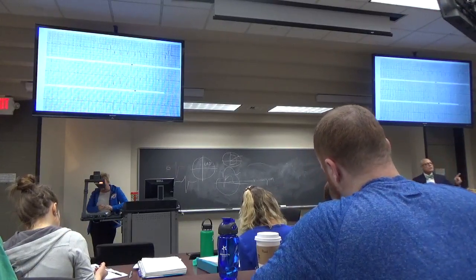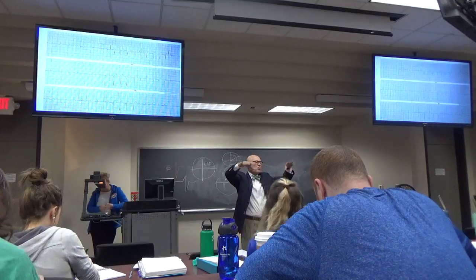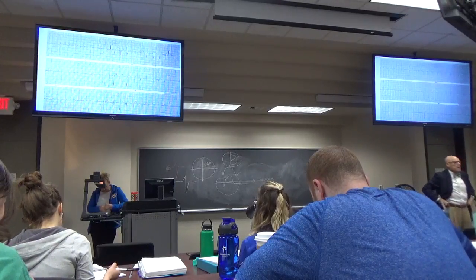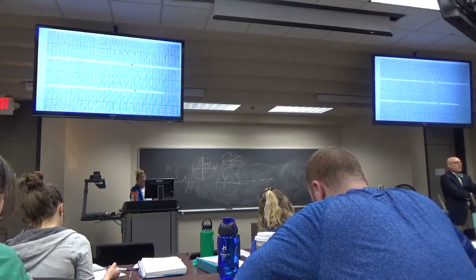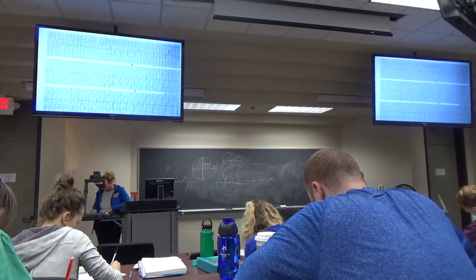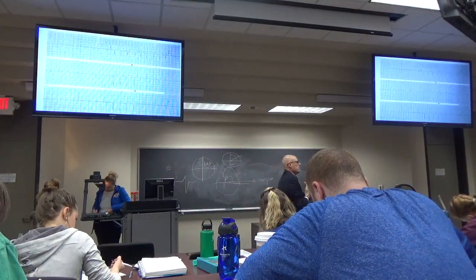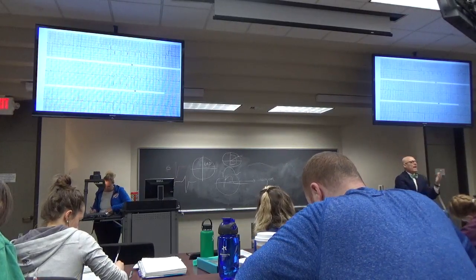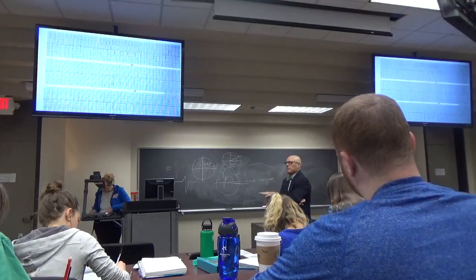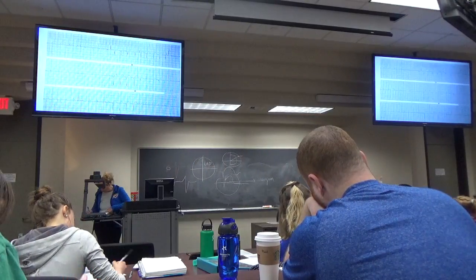Turns out, atrial fibrillation is one of the hardest rhythms to call on an EKG. Okay? Because there are almost always some squiggling going on in between R to R. There's almost always some squiggling, even in atrial fib. So the two tests for atrial fib: is there a P wave that's married to the QRS? Is the P wave causing the QRS? You can always find something between those R waves that look a little bit like a P. How do you know it's causing the QRS? Well, the P wave ought to look the same among its siblings. The P wave ought to look the same in 2, 3, and F. The P wave ought to look the same in 1 and aVL. The P wave ought to look the same in V1, 2, and 3. If there's a P wave, and if it's causing the QRS, that's a sinus rhythm.